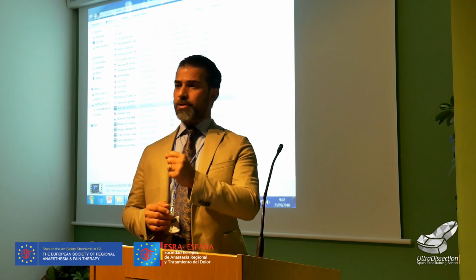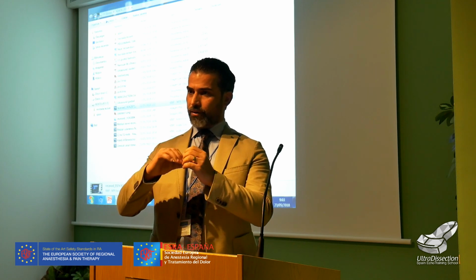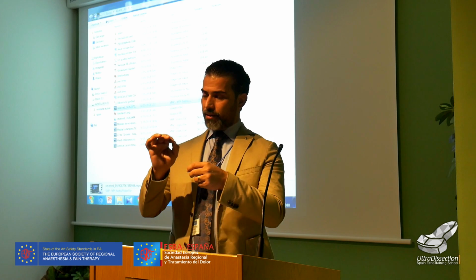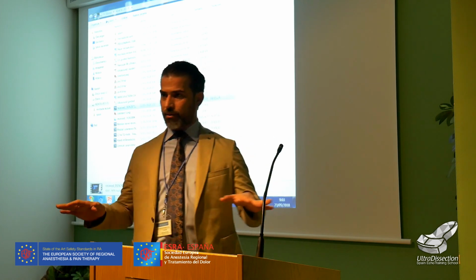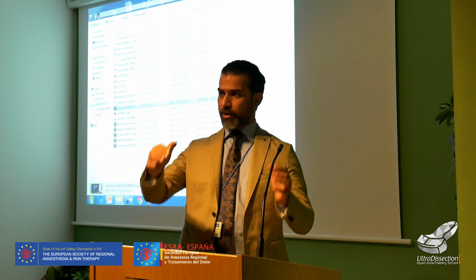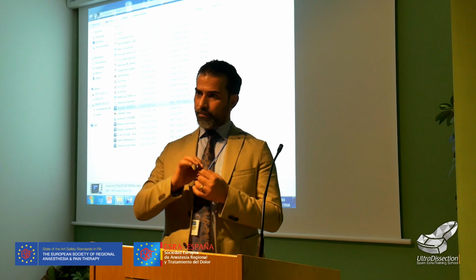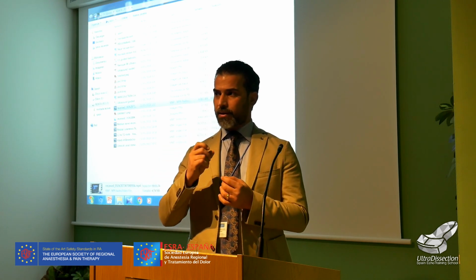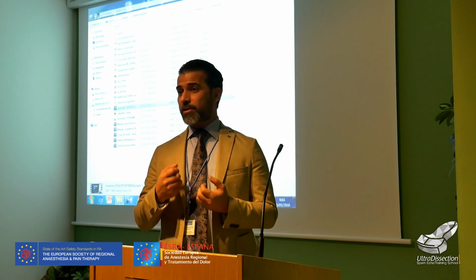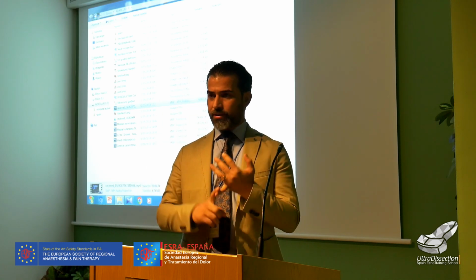So when I teach my resident to put the probe at L4, for example, to identify the vertebral body, existing foramen, transverse process, and put the needle here and just reach the foramina and then stop, put the ultrasound away and bring the fluoroscope, and here you can find out you are so close to the foramina. So put the needle tip in the foramen, inject the dye to see the roots and then complete your procedure. So ultrasound here is guide and aid to fluoroscope to decrease the exposure.